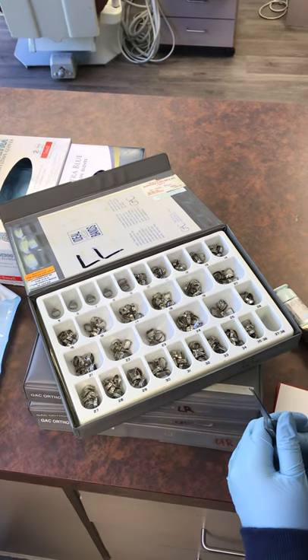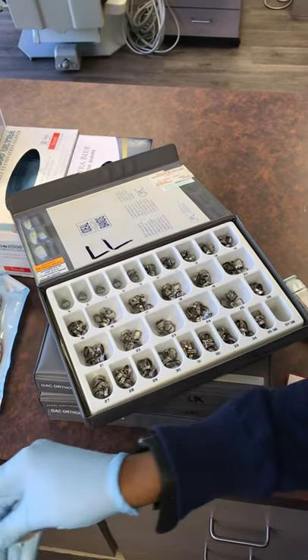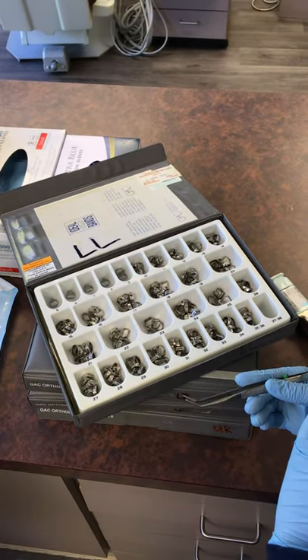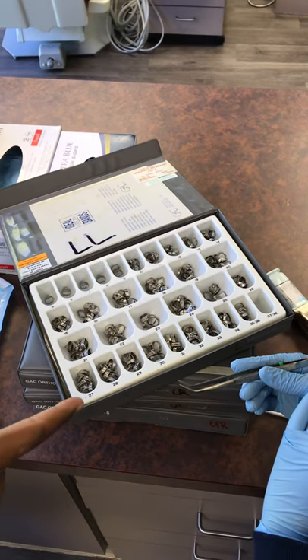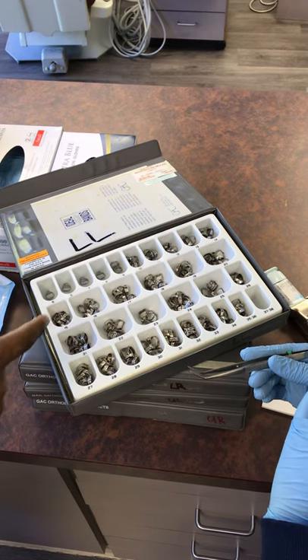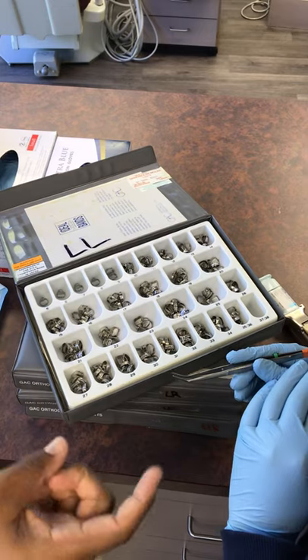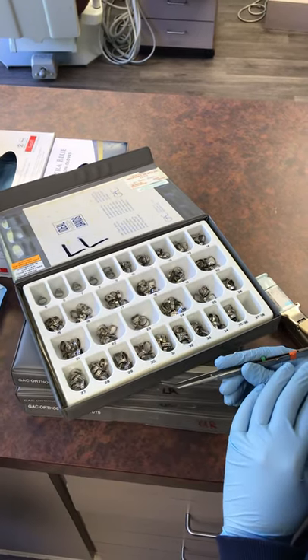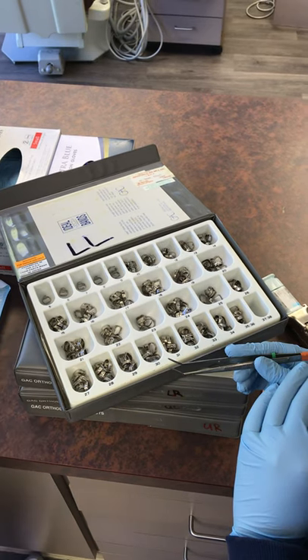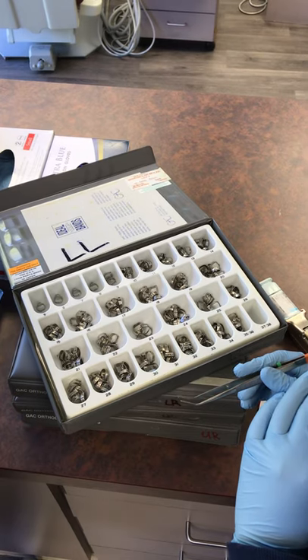Normally you'll be doing this by yourself — I've got an assistant, Tiana, helping me pick the bands out. Notice she's using a cotton plier to pick up the bands so that we're not touching the box of bands directly. That way we keep all of our inventory that's going to go into someone else's mouth clean. We're only using a clean instrument to grab each band. So, glancing at it, I just have an idea in my mind of what the size of that molar was.